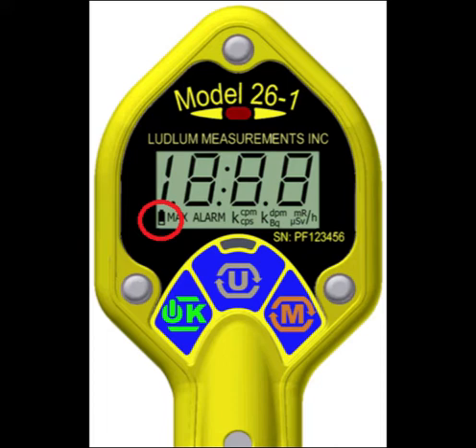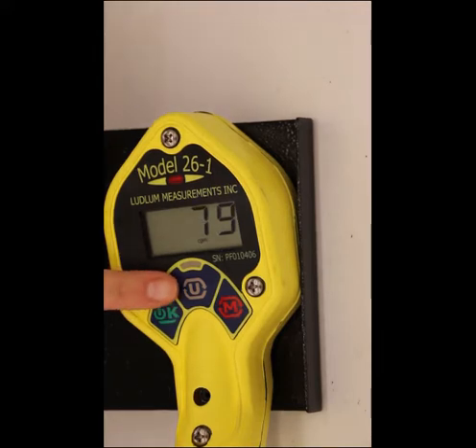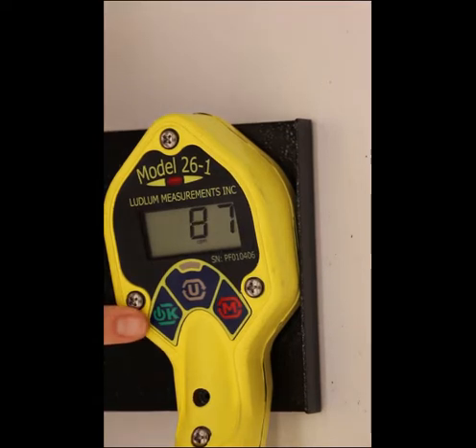If the instrument detects a battery voltage high enough to power on but too low to safely operate, the display will go blank and the low battery icon will flash. Normal operation will not be available until the batteries have been replaced. The primary display mode is the rate meter, and the current count rate will be displayed. Pressing the units button will switch the displayed value between the primary and secondary units.